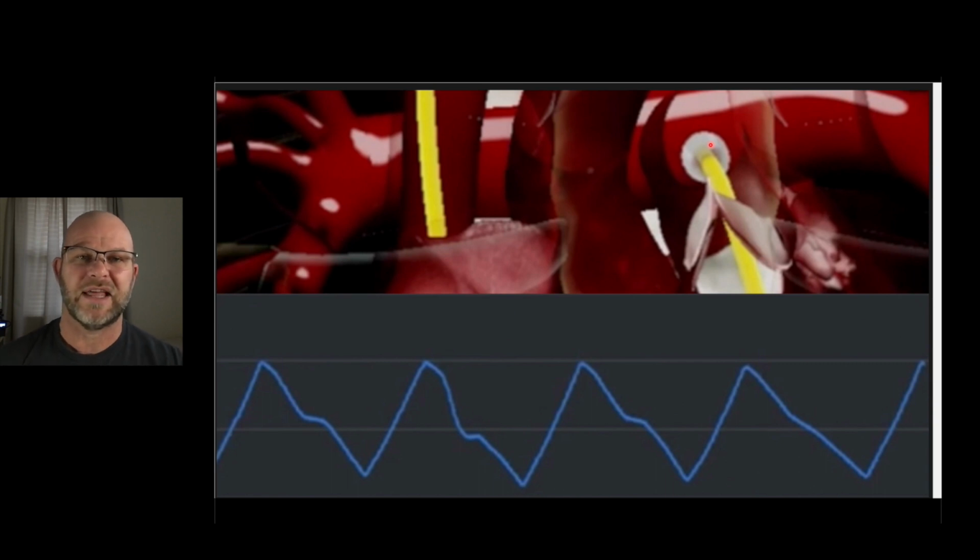And you can actually see that on echo. If you have put color on, you'll see that blood change direction just briefly. As that ventricle starts to expand, it pulls blood backwards just a touch, because it's pulling blood from the atria. It pulls a little bit of blood back from the pulmonary artery, but it catches the valve parachutes, the valve leaflets, and slams those shut.